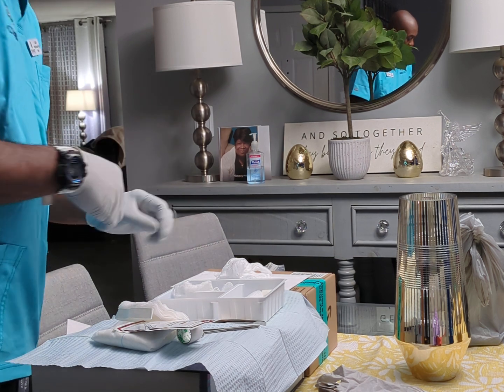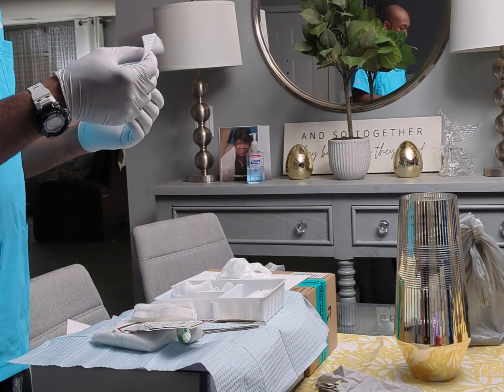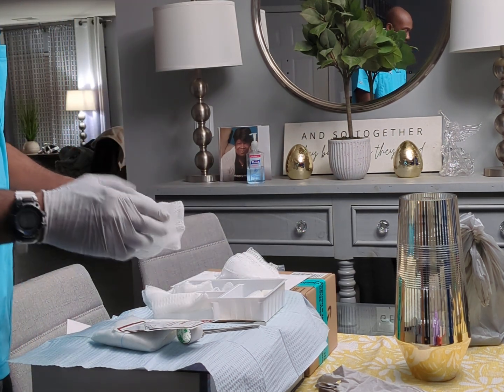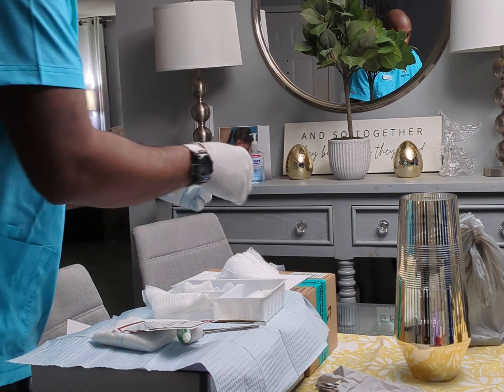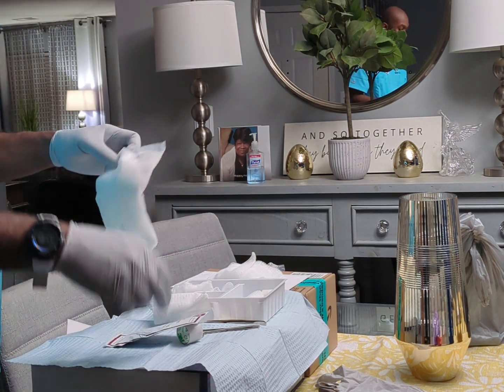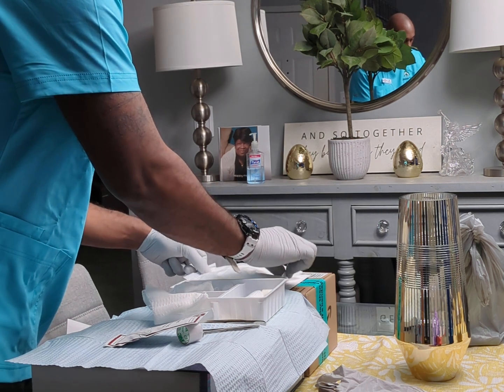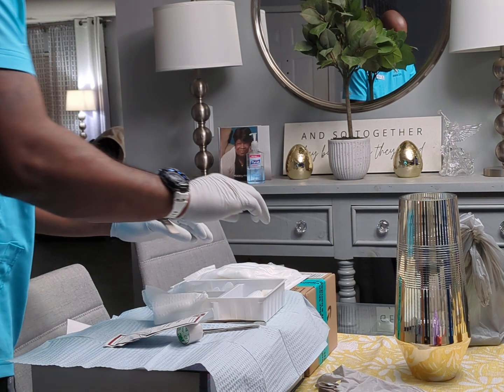So the wound is packed, and after that I would take some sterile ABDs and put them on top, then sterile gauze on top, and then my ABD on top of that.